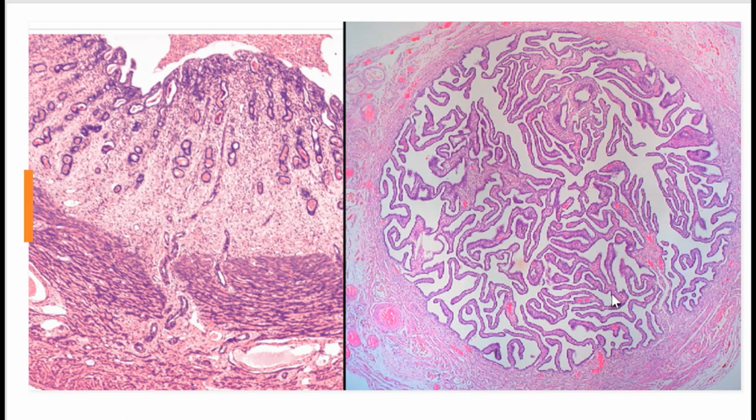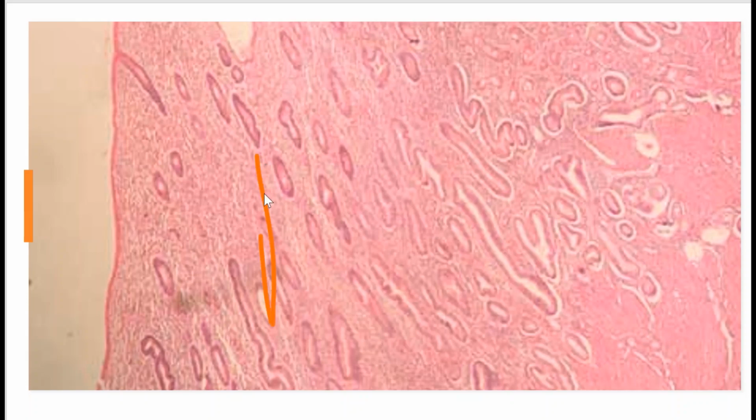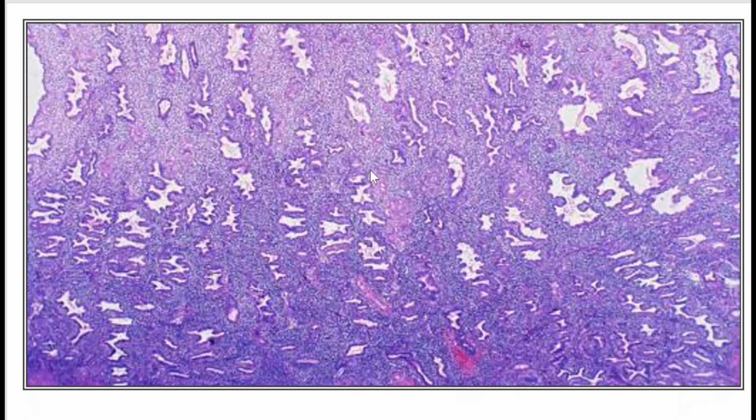So the glands here, as you can see, are slithering like snakes. So this would be the secretory phase here, secretory. And then when we're looking at these glands, they're not as much slithering like snakes. They're more short and kind of straighter than these, right? So this would be our proliferative stage. This is proliferative here because they're going straight. This is secretory because they're all crazy and doing their craziness things that they do.